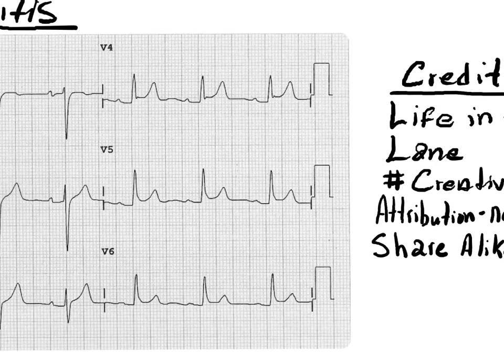Let's move on to V4. What do you see here? Definitely elevation. Did you guys agree? There. All right. Look at that. The P to R segment is depressed as well. All right. V5, V6 look the same.